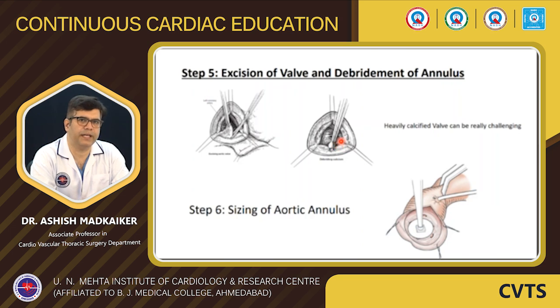And also while debriding calcium, we should take care that we don't have any debris getting embolized once the surgery is over and cause embolic strokes. Sometimes we might have to use special instruments like rongeurs to crush the calcium and then debride the annulus carefully. So we need to take due precautions so that we don't cause much injury. At the same time, we should get optimal debridement and proper excision of the valve.